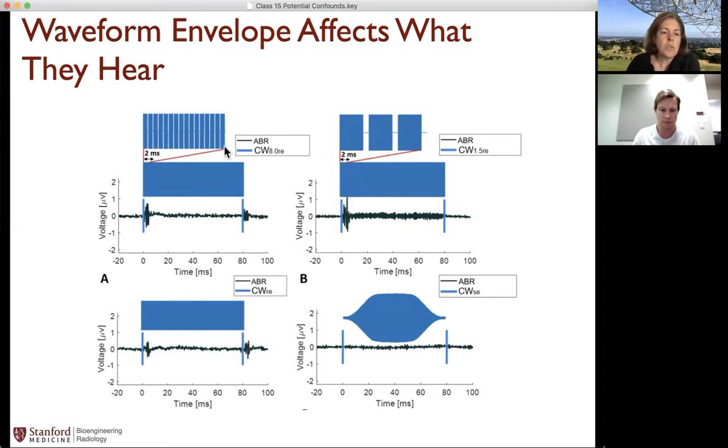We looked at also 2 different pulsed waveforms, and they're just at different frequencies. So this was an 8 kilohertz PRF, and then a 1.5 kilohertz PRF. And then you look at the ABR for both of them, and you can see that, again, it's right after the on and then right after the off for both of them. And then this is really interesting. Here, it seems like there was maybe a little bit of a response during the 1.5 kilohertz, that they could hear something throughout. So that makes some sense.